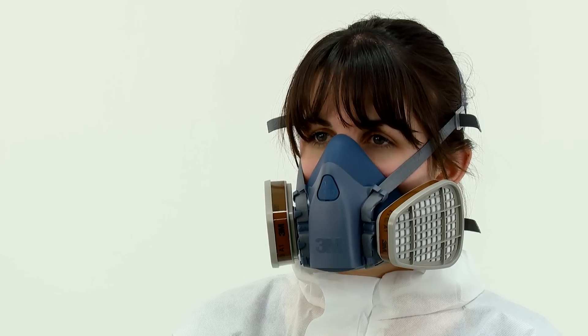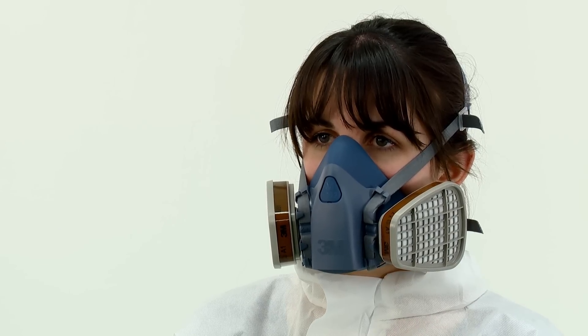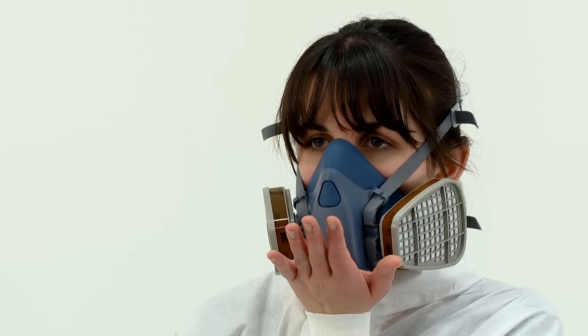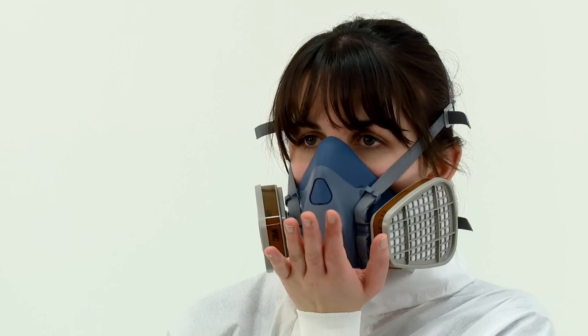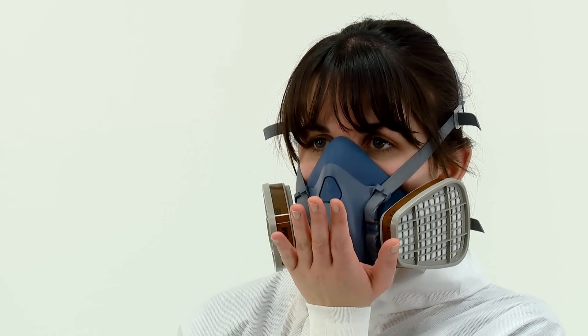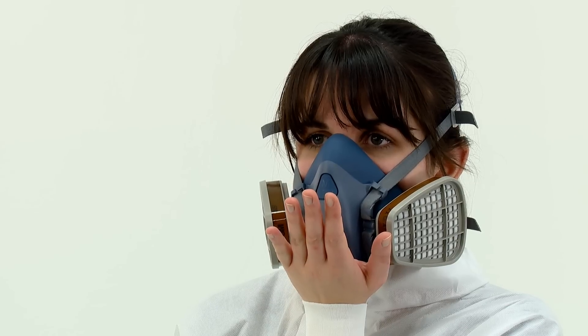If gas and vapour filters or combination filters have been fitted, a positive pressure fit check is performed by placing the palm of your hand over the exhalation valve cover, being careful not to disturb the fit of the respirator. You should then exhale gently. If the face piece bulges slightly and no air leaks are detected between the face and the face piece, a proper seal has been obtained.